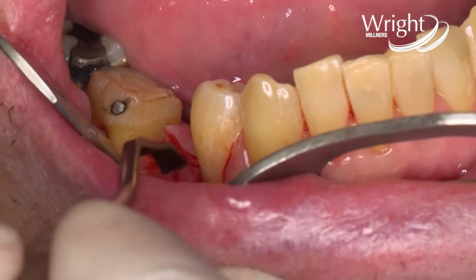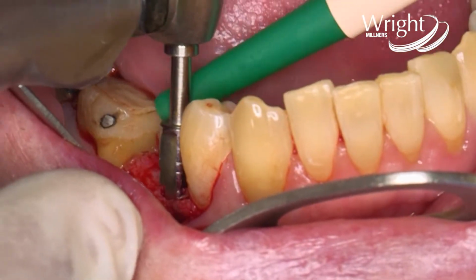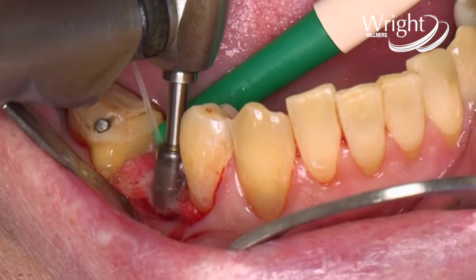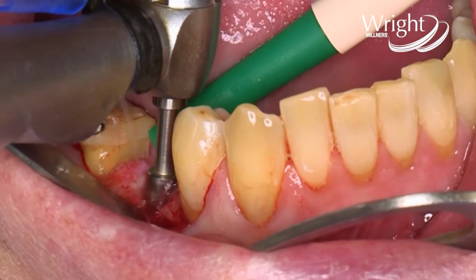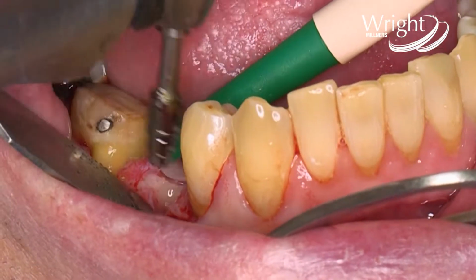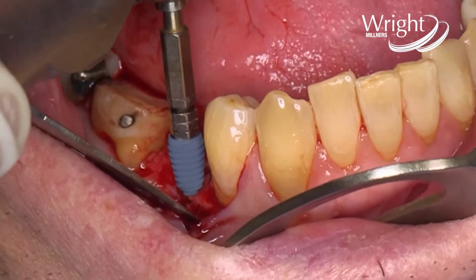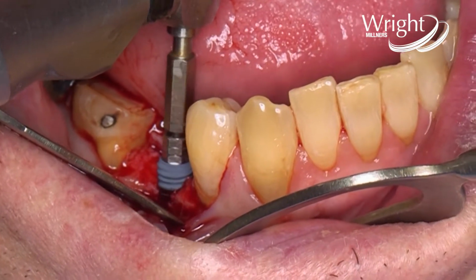So now we move to our profile drill, and we're going to place a 4.5 diameter implant. So we go with the profile drill first at the reduced speed, and we go now the full length of the profile drill, which is 8mm. Okay, so we're taking the 4 profile drill because we're going to place a 4 by 8.5. You can see this implant's got an enhanced surface because it has that denim-ish grey color to it. And now we're going to set our speed to the placement, 45 torque and 30 RPMs to place the implant in.